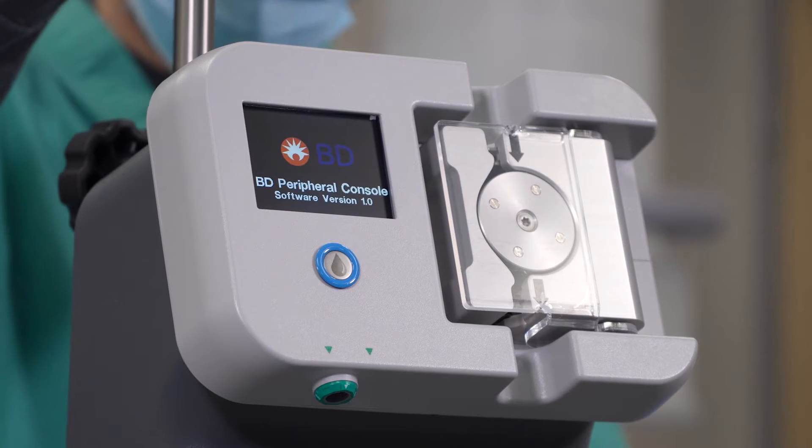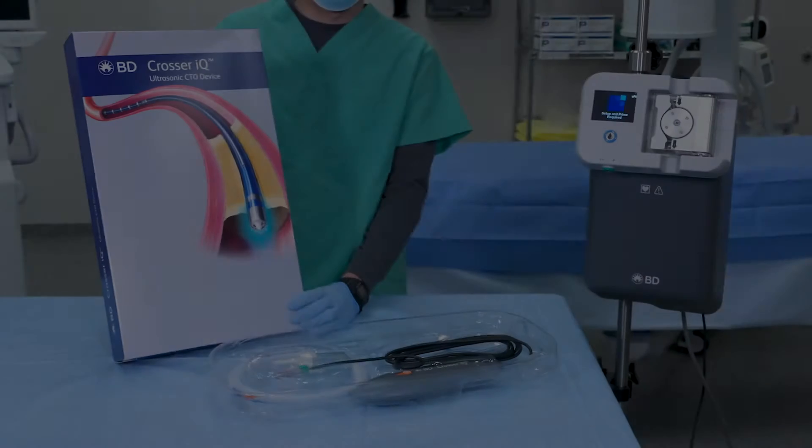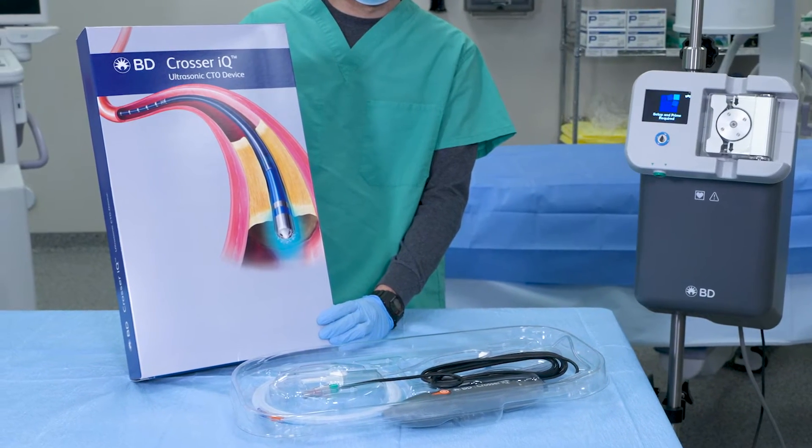The LCD screen will show the BD logo, then quickly transition to the Setup and Prime Required screen. You'll also see the footswitch icon displayed on the LCD screen.